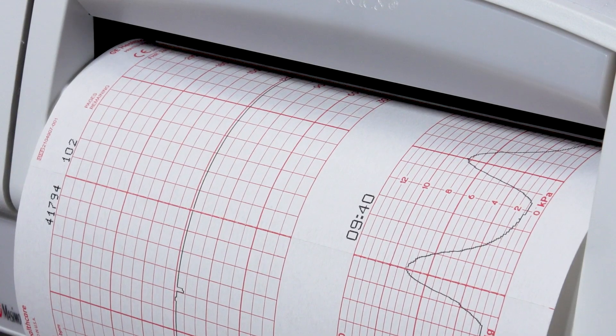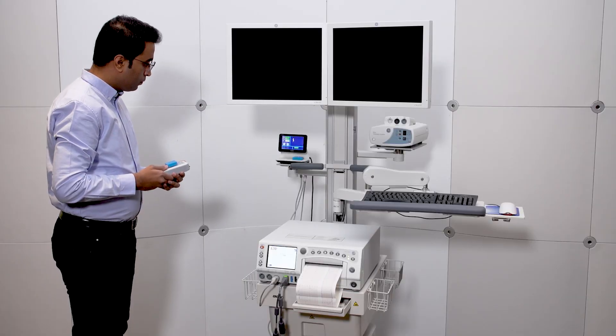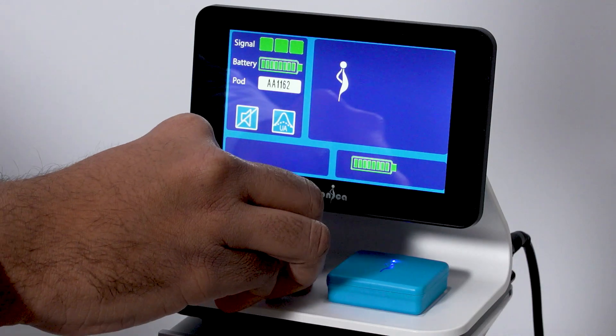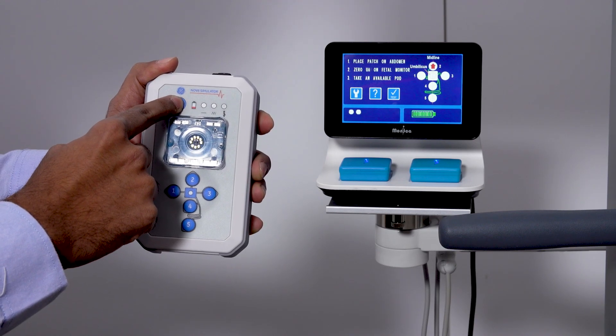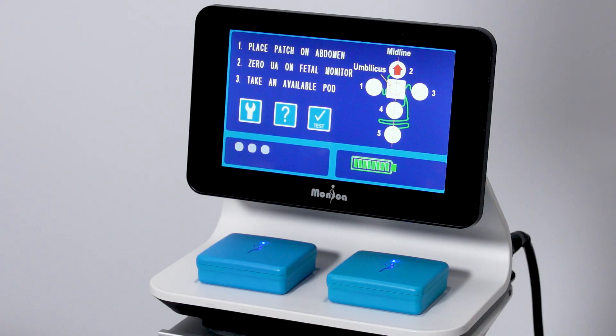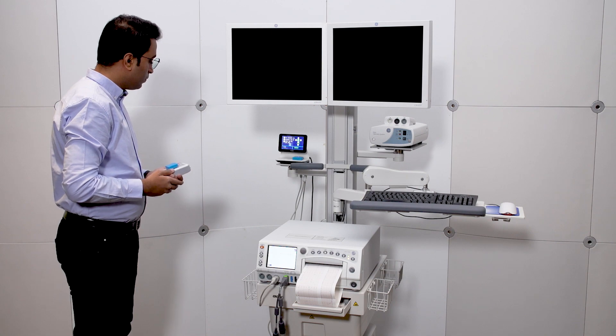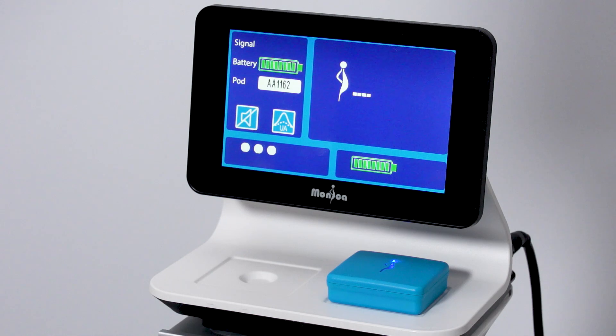And the strip can be compared as well. We will now show demo mode. Restart the simulator again by placing the pod back on the interface. Change the mode to demo. And then replace the pod on the simulator pod clip once the battery indicator appears on the Novi screen.